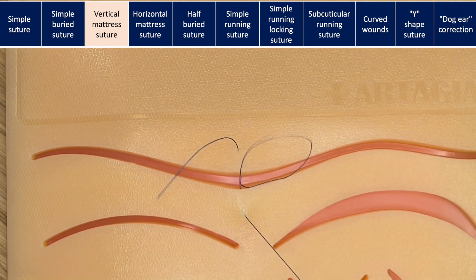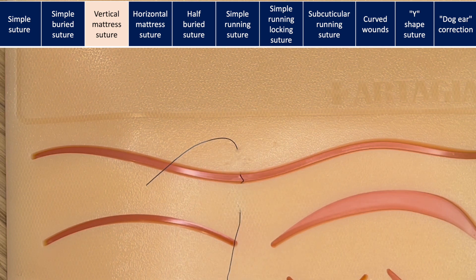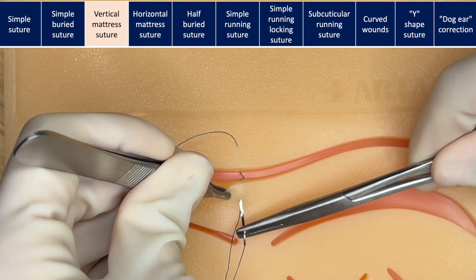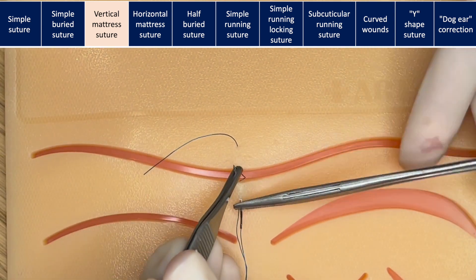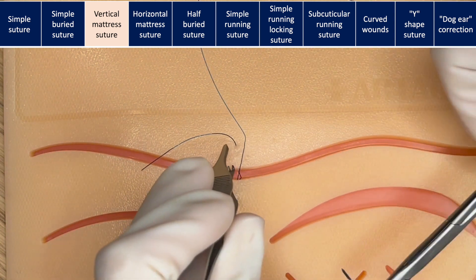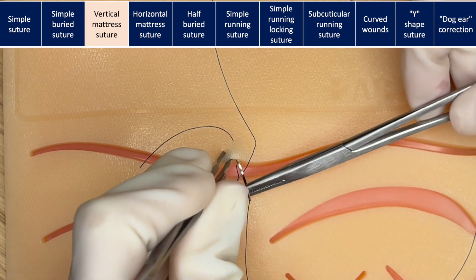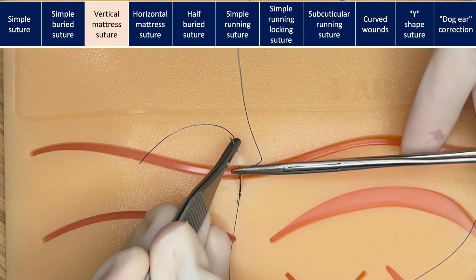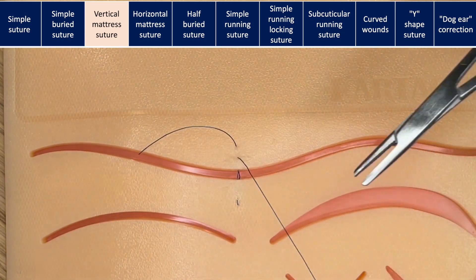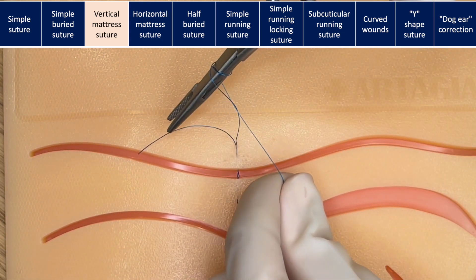Then you're going to turn the needle around, come back, and do the near-near to the incision. This pulls the tissue between those threads together and is useful to take tension off when there is a lot of swelling, edema, or in wounds with a higher risk of dehiscence.